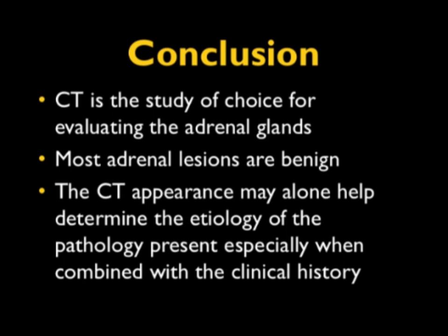So a careful understanding of the different scenarios, a careful understanding of the various pathologies I've gone over with you. I think recognizing an adrenal lesion, that's step one, but figuring out what it is, step two, is the key step. And if you follow the rules I told you, I think you will get most of them right most of the time.